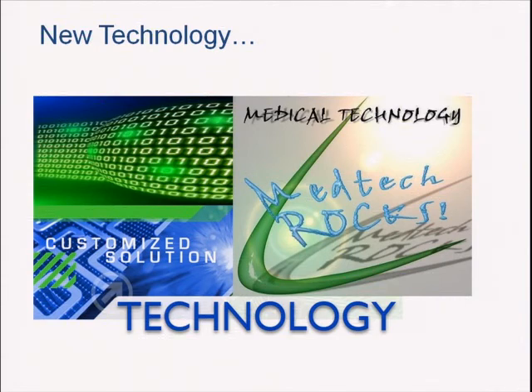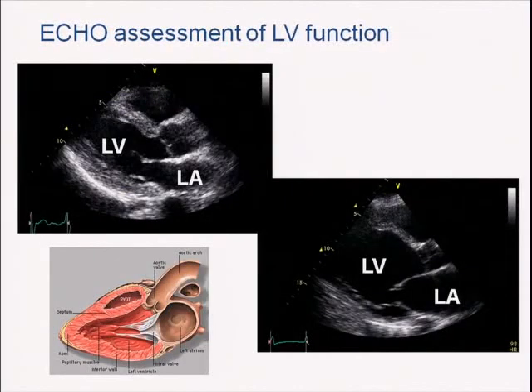So I think the days of the CVP and the Swan are really dead. So I think the first thing is bedside echo. And I think this is, every intensivist should have the basic skills of doing bedside echo. It is so valuable in the immediate management of patients.